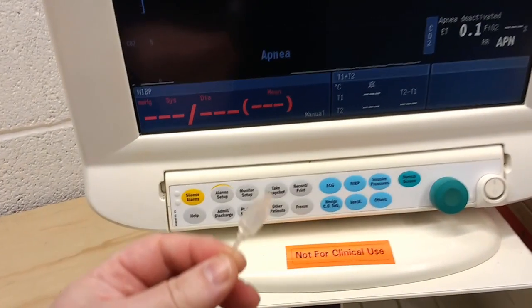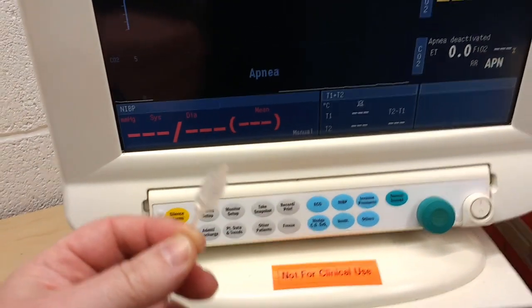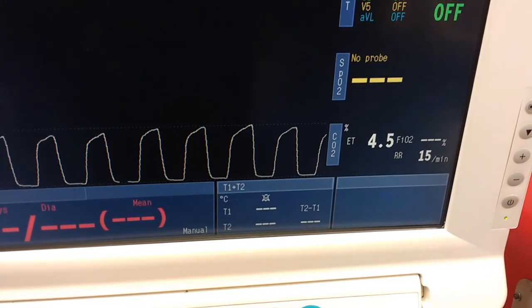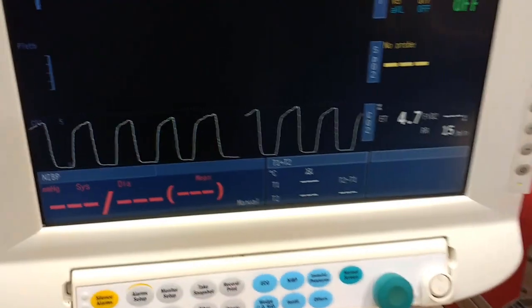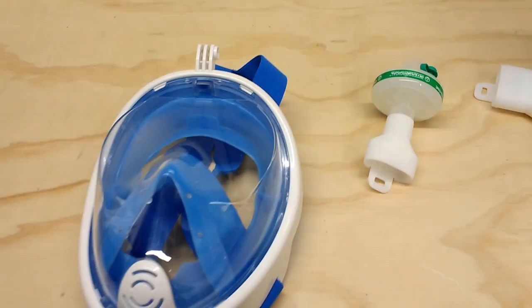First of all I'll just breathe with this just inside my mouth to see what my baseline end-tidal CO2 is. Okay, so 4.5, 4.6% - that's reasonably normal, which is what I was hoping for.